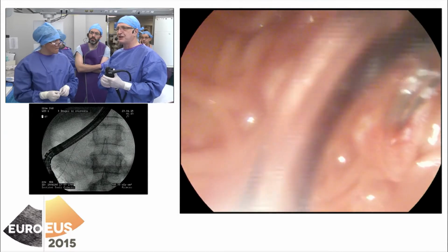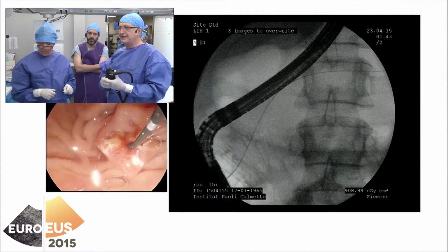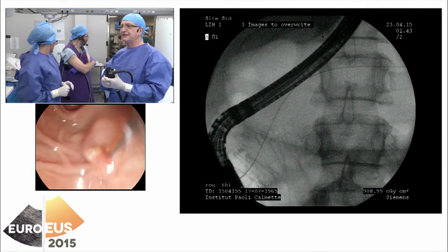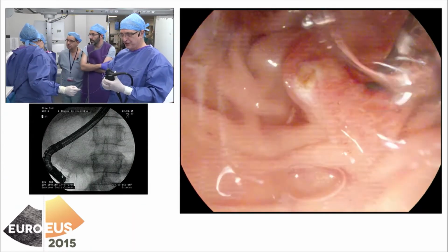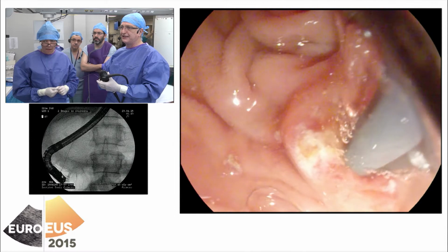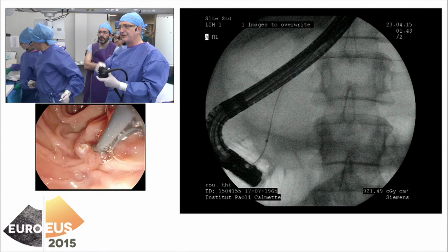I would just remove the two stents and see if the patient has a relapse of symptoms. So what I use here is the Oasis from Cook with an 8.5 French stent, which has been modified by Sonia to be a fusion inner guide. And as you can see, this is my guiding catheter. You see that the guide wire is entering the catheter on the side there.